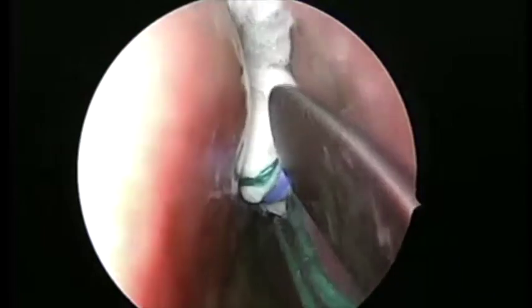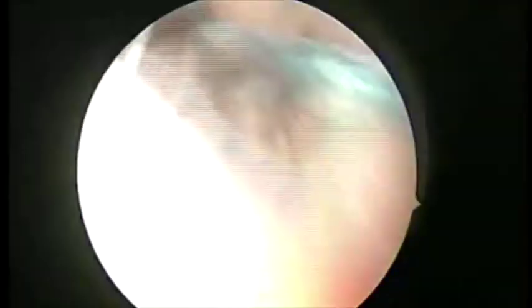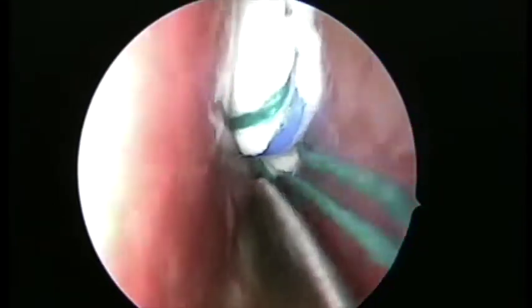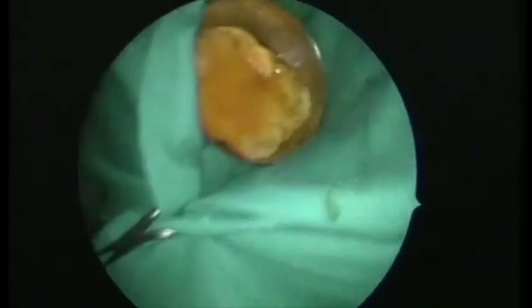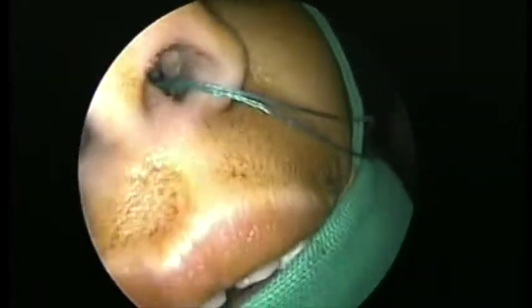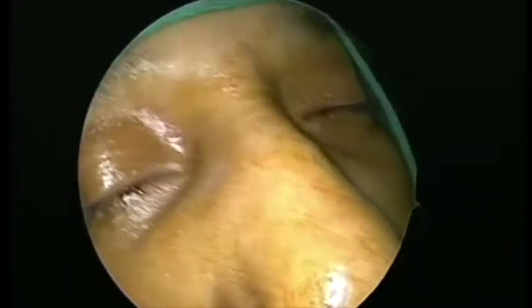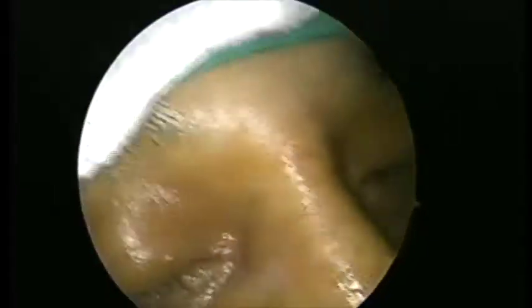I have removed the patties placed in the induction room and placed new patties under endoscopic control in the middle meatus on both sides. These patties have been soaked in the Moffat solution. This patient has bilateral polypoid disease. The interesting thing is that the frontal sinus on the left-hand side is very rudimentary - very small, almost absent - and on the left-hand side is opacified. There was considerable demineralization of the bone. The critical areas: the anterior ethmoidal artery is running in the skull base, the skull base is Keros type 1, and there was no Onodi cell. With that information, I am now going to start with the surgery on the left side first.